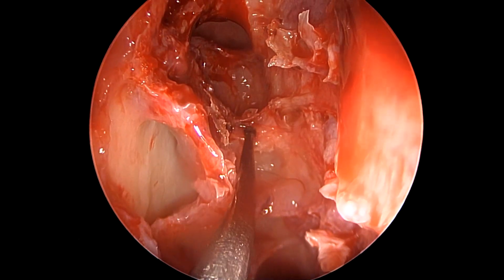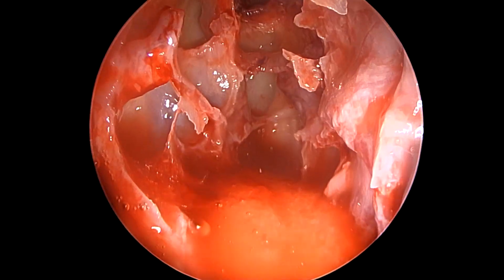This is the anterior ethmoidal artery. This is the posterior ethmoidal skull base, the lamina.